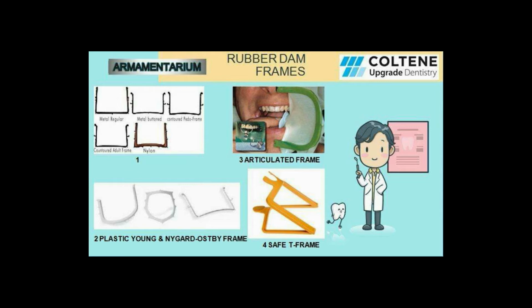Now the next one in rubber dam armamentarium is the rubber dam frames. The first picture shows some of the metal frames. The first one is metal regular. The second one is metal button. Metal button aids in the tucking of the rubber dam sheet onto the buttons which are provided in the frame.